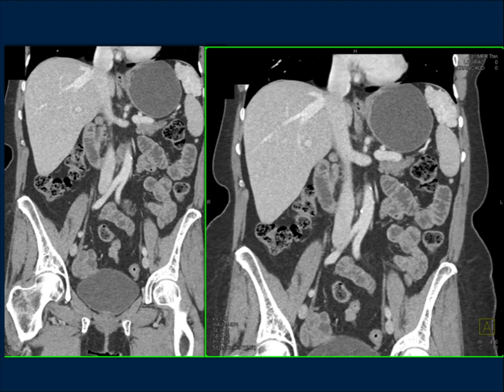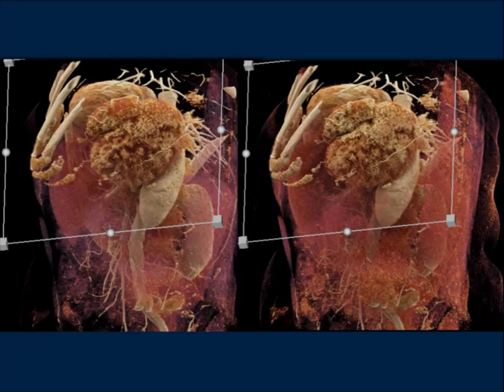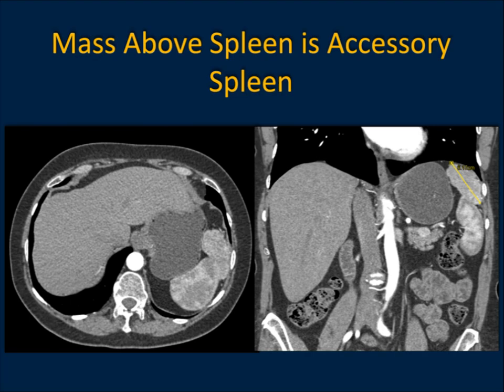It looks like a spleen, but it's a funny location. Accessory spleen is typically near the splenic hilum, but could be almost anywhere. This one is above the spleen, which was kind of weird, and the patient was symptomatic. On cinematic rendering, you can see a small feeding vessel from the splenic artery. Its texture is a bit different than the regular spleen, but it also has some similarity in the moiré pattern. I believed the best diagnosis was an accessory spleen. Because the patient was symptomatic, they removed it — and it was indeed an accessory spleen.